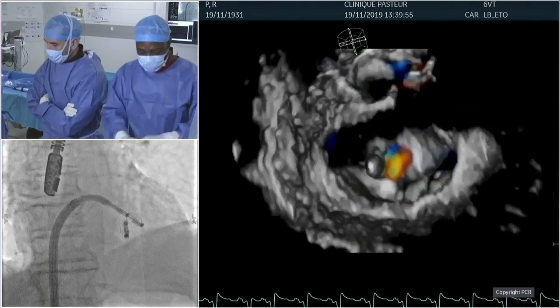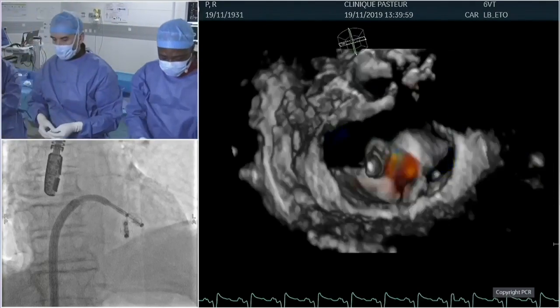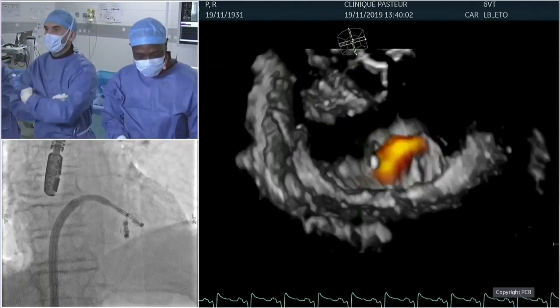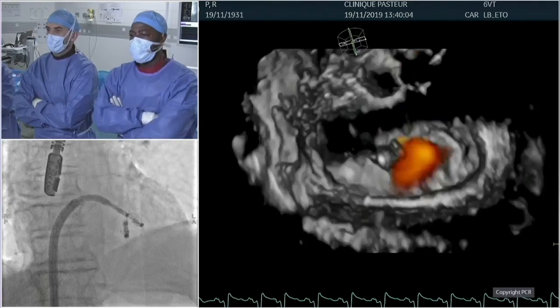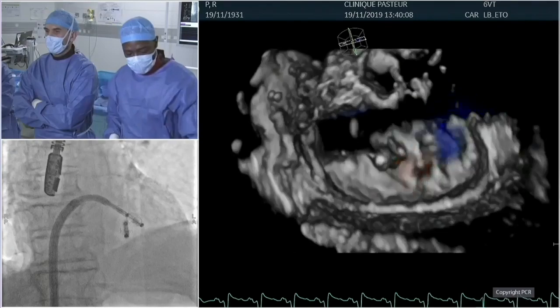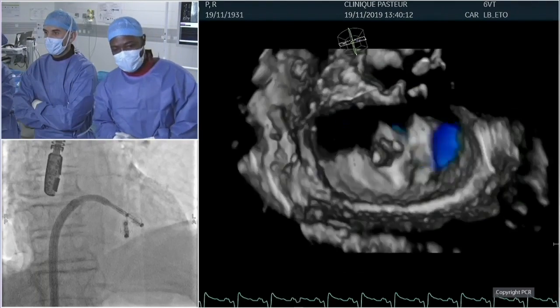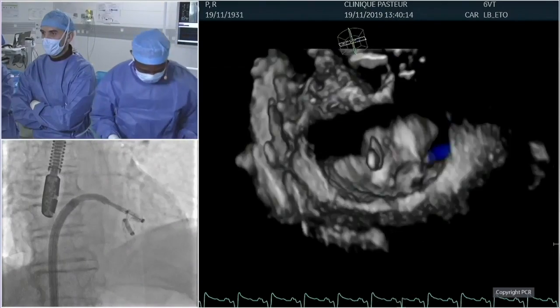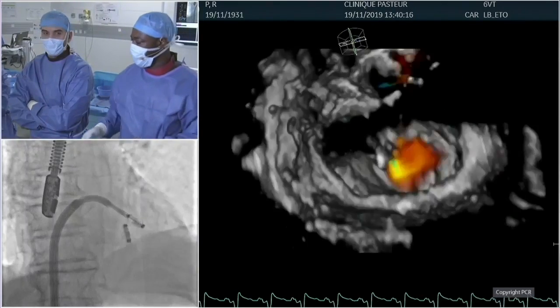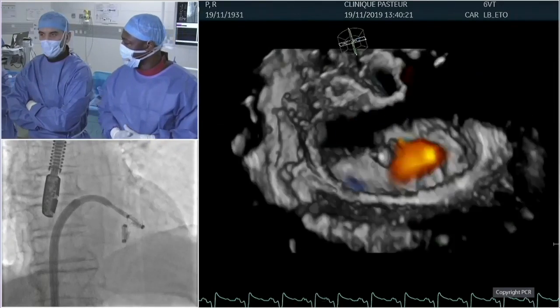So what do you think, Lars? Philippe, what's your perception? Becky, Jeff? Yeah, I think this is a very, very nice demonstration of a very planned capture of the P2 prolapse, and it was not easy. I don't think it was an easy case. Yeah. Nothing is ever easy till you do the case. I think Nico, you did a great job. You had good imaging, but not perfect imaging, so that was more challenging.